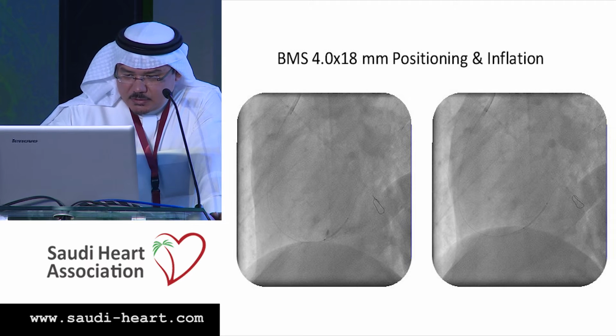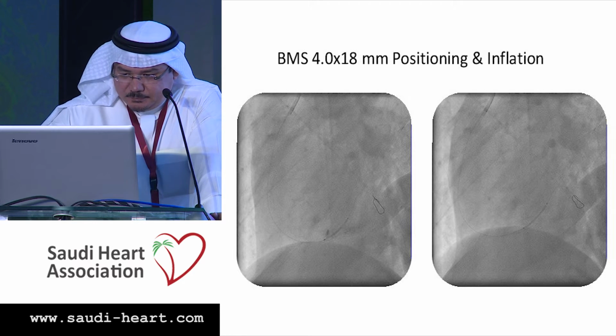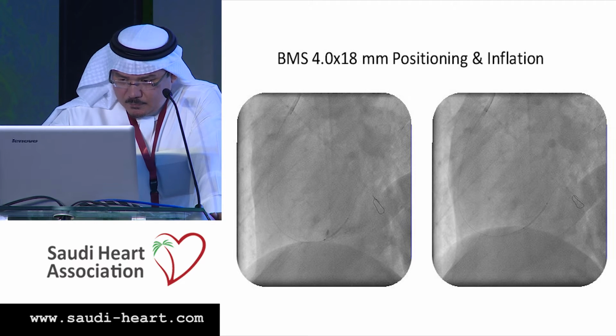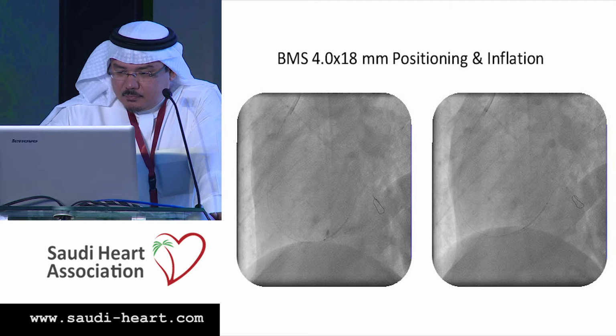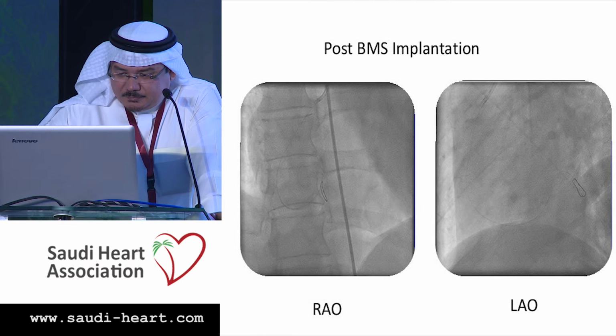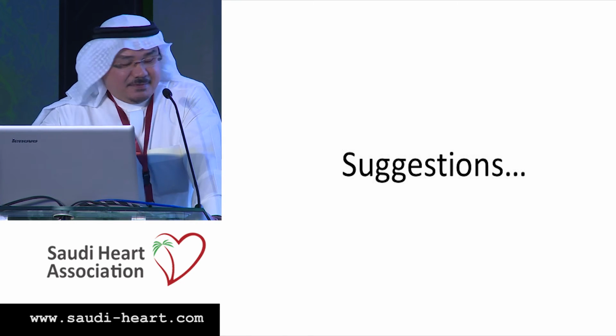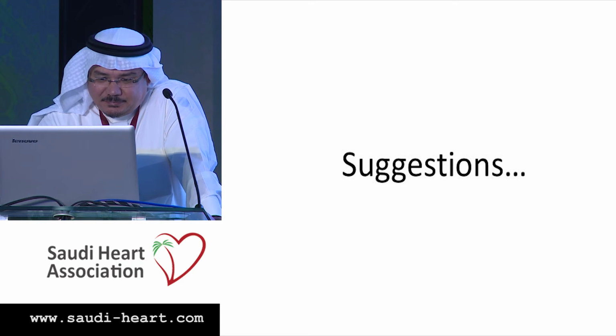This is the stent inflation in the RCA. And this is the view post-stenting. This is the stent area. There is a formation of thrombus inside the stent, plus the haziness which was there before as well. So what's next again? Stent implantation did not improve much. Actually, it made it worse also. Okay, so carry on, Dr. Abdullateef.